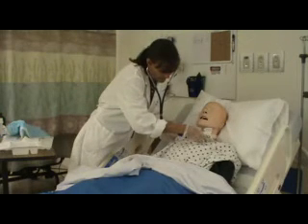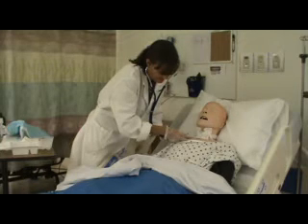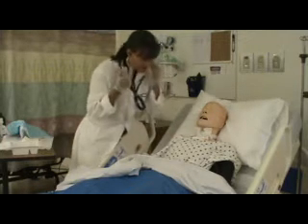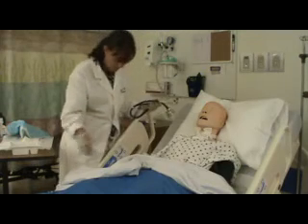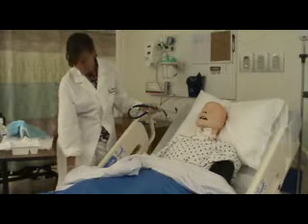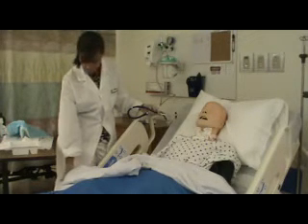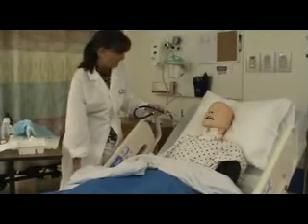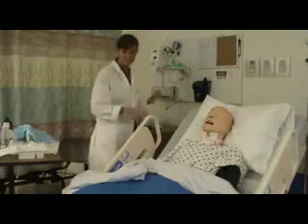Just take a deep breath, please. And again. Great. How are you feeling? Wonderful. Do you feel that it's easier to breathe? Yes, I love all these students — it's easier to breathe when there are students around. Yes, it is. And your pulse ox is up to 96. This was effective tracheal suctioning.